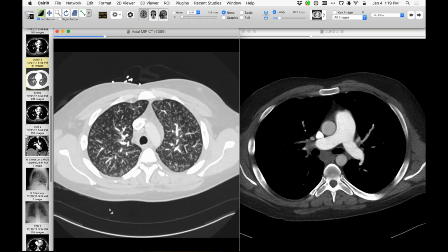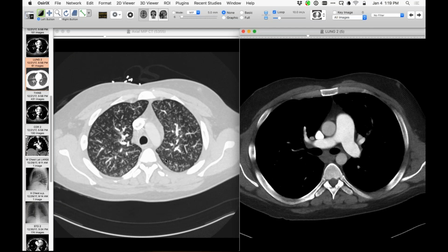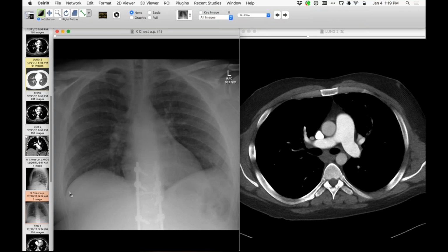No, he didn't have an intravenous catheter in place, or does he? He's got a bunch of tubing in front of him there. Yeah, because the availability is a big component in this. They have a catheter.